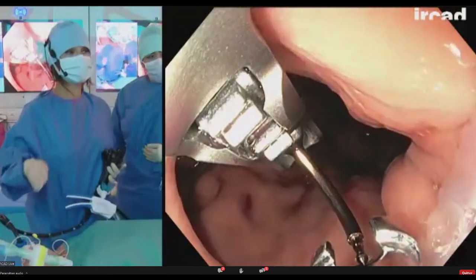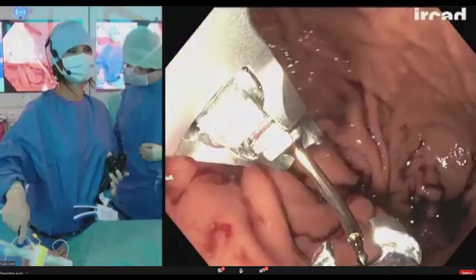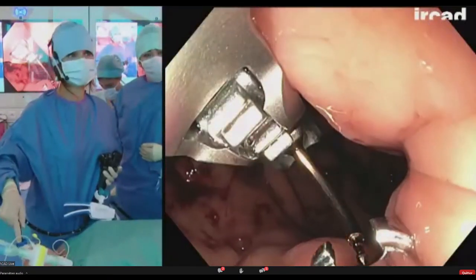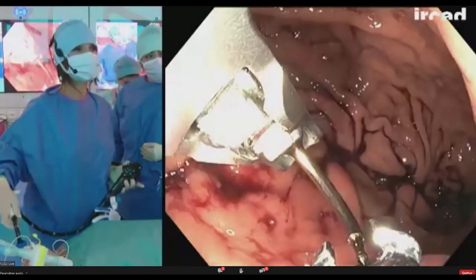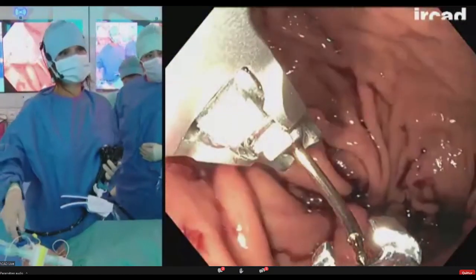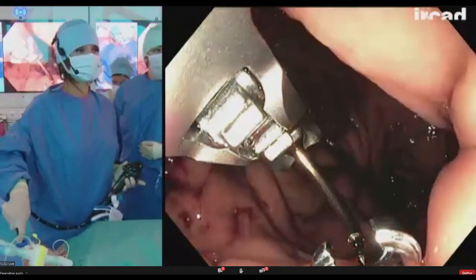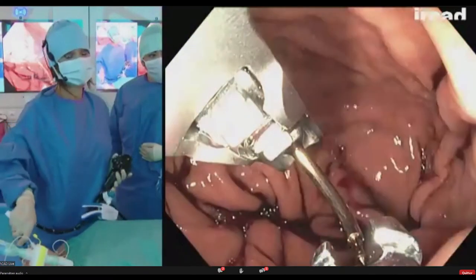And my landmark is when I go inside, I see directly my sleeve. I don't see the fundus. And I don't like to move around my device, especially the double channel device, around the esophagus. So if you're starting, don't be too aggressive, don't be too greedy, and stop right here when you see with your scope that you're backing up into the esophagus.